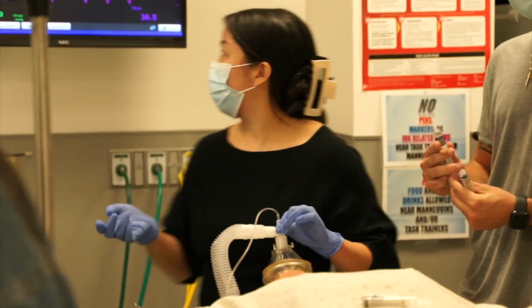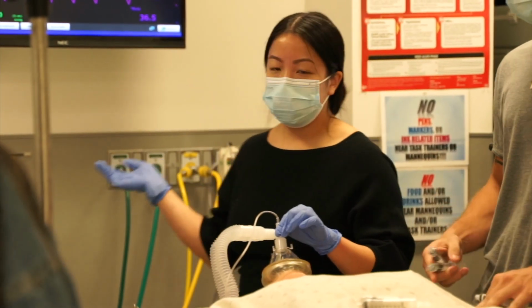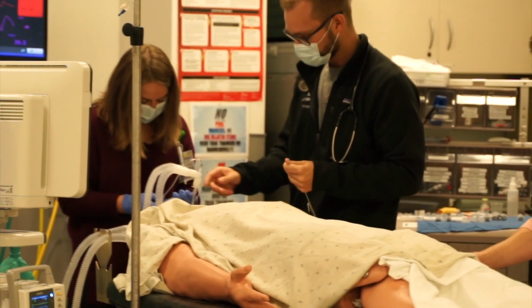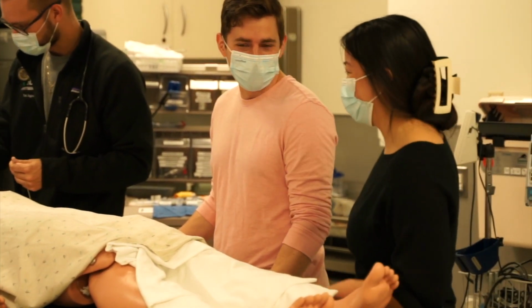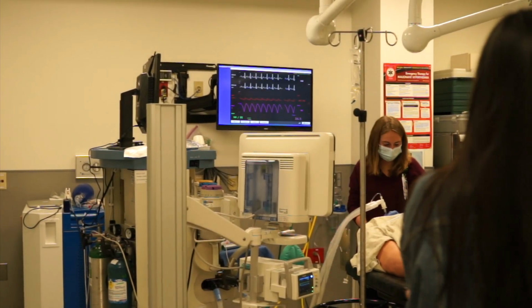And then they're also going to do a bypass sim where they work with the perfusion students to put a patient onto cardiac bypass, and they can go through the steps of communication that happen as a group transitions a patient onto cardiac bypass. The equipment that they use today includes the high fidelity OR simulator.